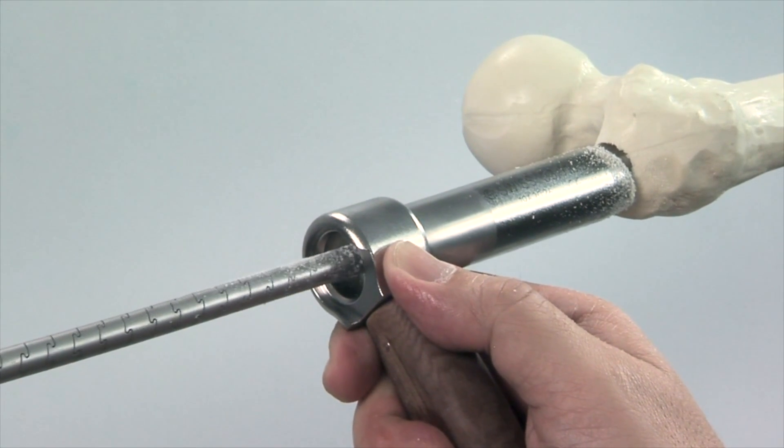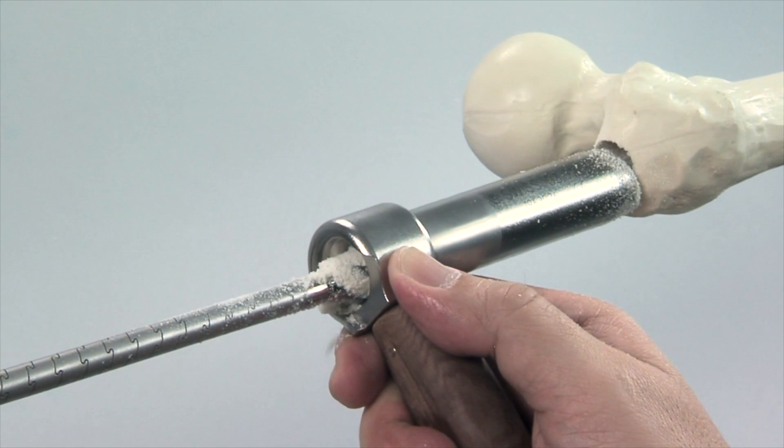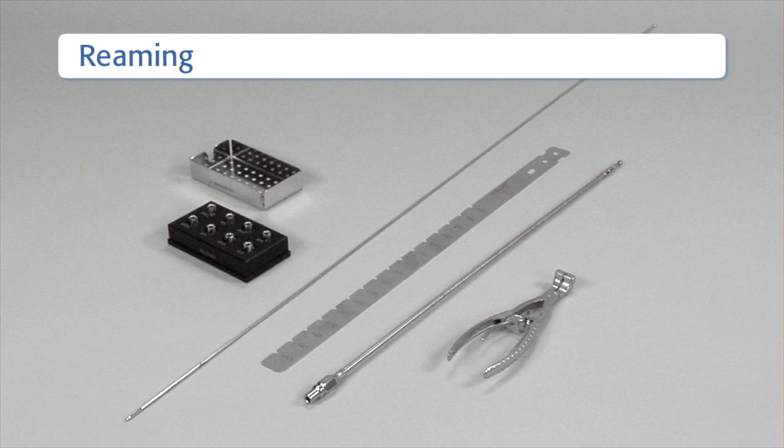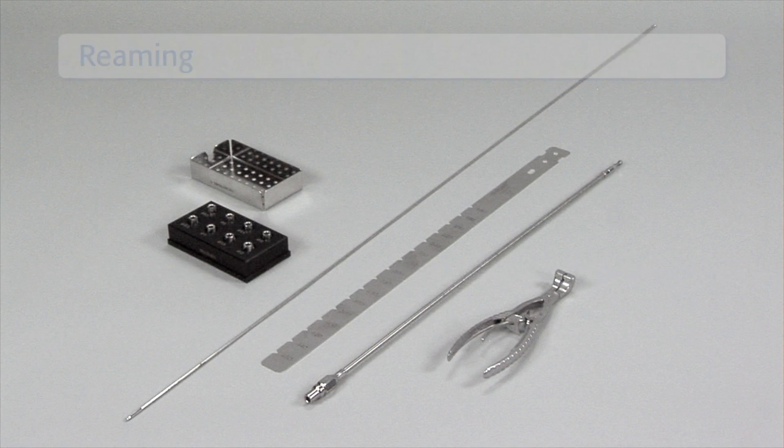The A2FN can be inserted with or without reaming. In this exercise, the bone model will be reamed. To ream the femur, the following instruments are used: a set of syn-ream reamer heads with the removal box, two 2.5mm syn-ream reaming rods, the radiographic ruler for expert femoral nails, the syn-ream flexible shaft, and the holding forceps for reaming rods.